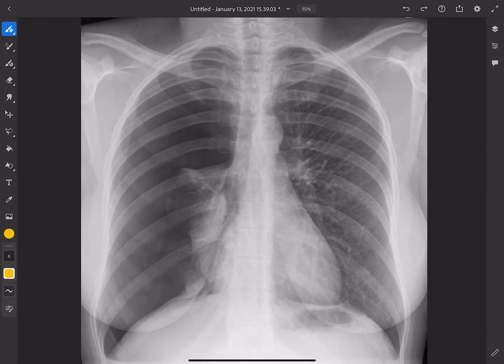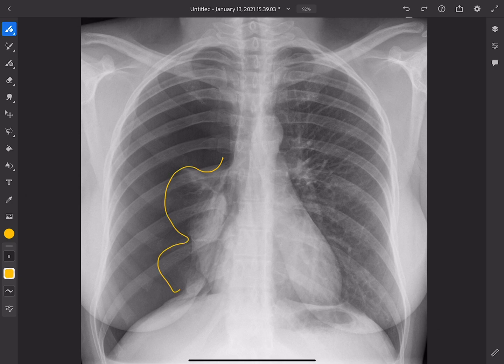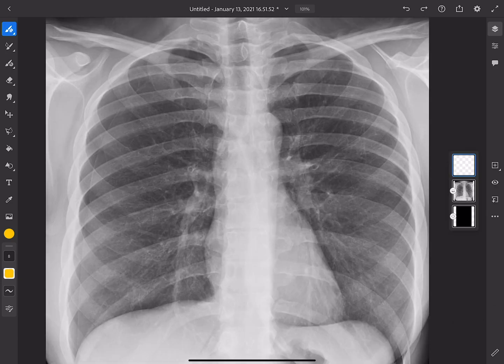Here's a case in which we have a pneumothorax and near complete collapse of the right lung. This right here is the visceral pleura, and you can see the lung is almost completely collapsed with just a little bit of aerated lung remaining. However, most pneumothoraces do not look like this. This next case is also a pneumothorax — you can see the thin visceral pleural line here — but the lung is still about 90% or more aerated, and no radiologist would call this a collapsed lung.